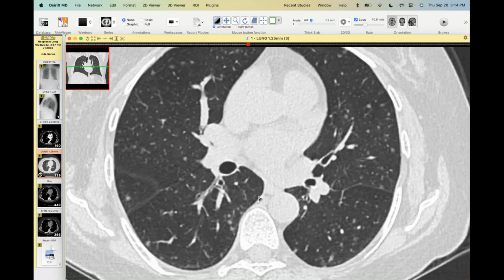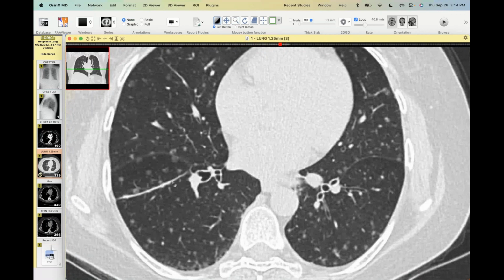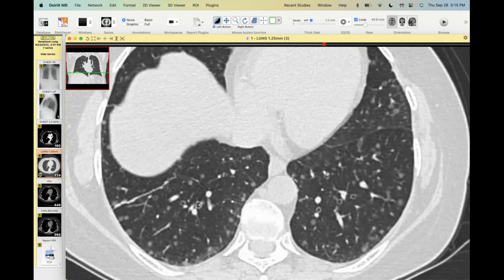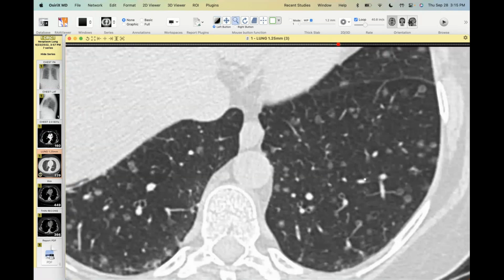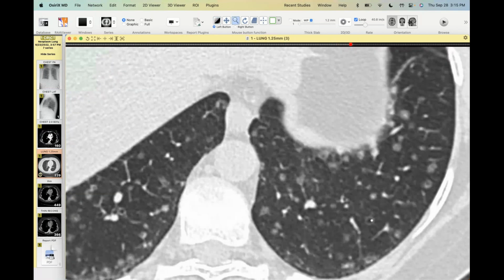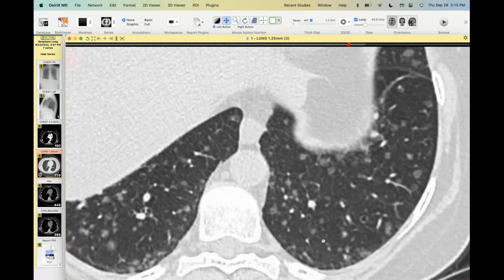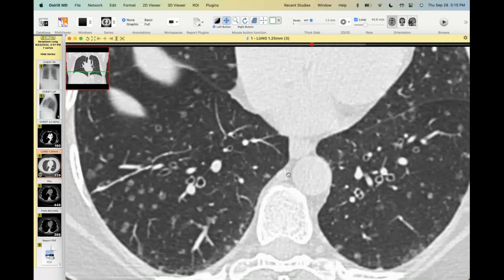Most of them are very low in attenuation, ground glass, not solid. Some of them have that almost little Cheerio look to them, or micro Cheerios. These were followed over the course of a few months before they did a surgical lung biopsy. That's a good Cheerio right there in the left lower lobe, and right there as well. It's pretty extensive here. That one's a little bit more discrete Cheerio, but these were all meningothelial-like nodules. So the pathologist called it diffuse meningotheliomatosis.